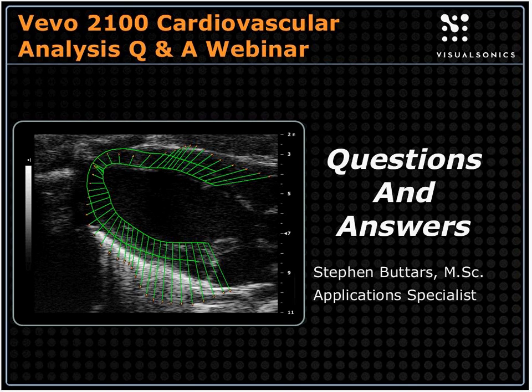What we're doing today is really a new format for us. We've done these webinar sessions in the past, but this is the first time we're really going to focus on more of a question and answer type forum. This is based on feedback we had from many of the listeners and users of the Vevo systems. So we thought we'd try something new. We've got a number of questions that have come in through the registration. People have posted questions. I see some people are starting to post questions already using the chat window.